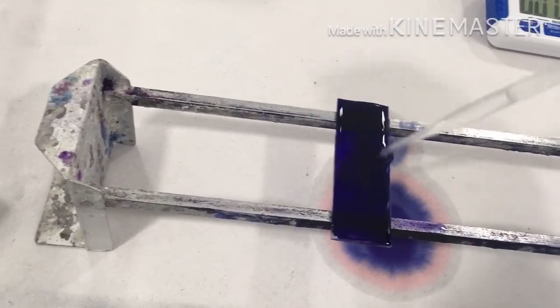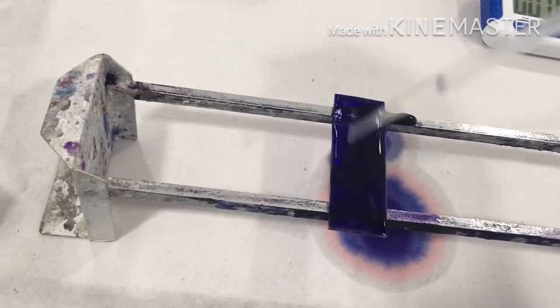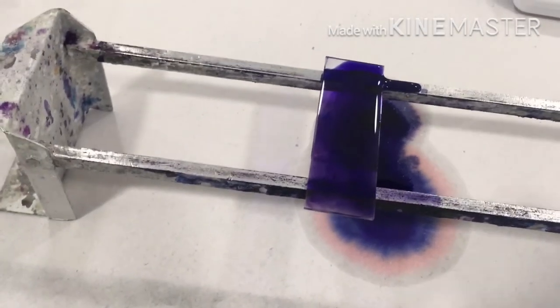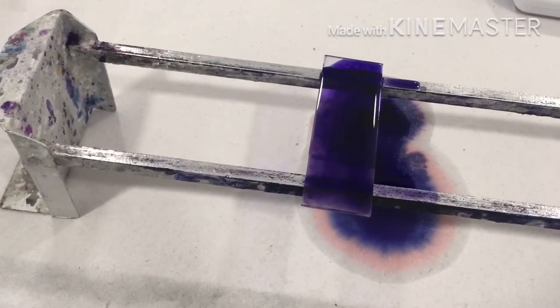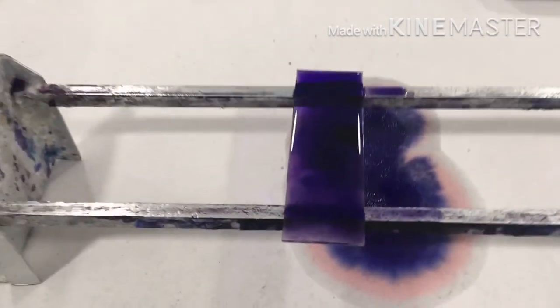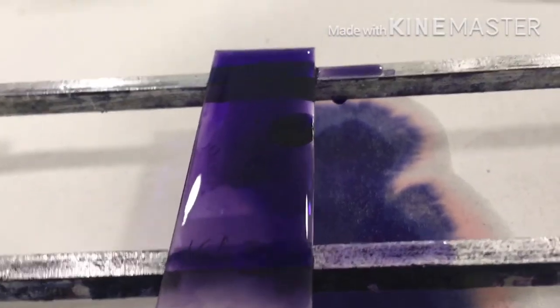Now add double the amount of stain. If you have added 8 drops of stain, then we have to add approximately 16 drops of buffer. And here it's flowing out, which should not happen.